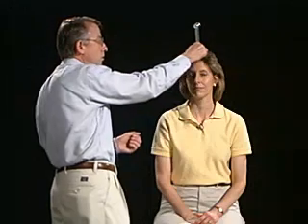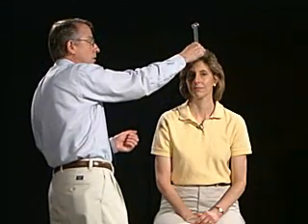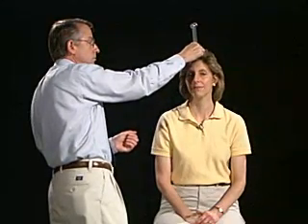We can further test that by doing the Weber-Rinne test. The Weber test is actually using a tuning fork, placing it on the forehead. Do you hear that on one side, or the other, or the middle? The middle. Good.